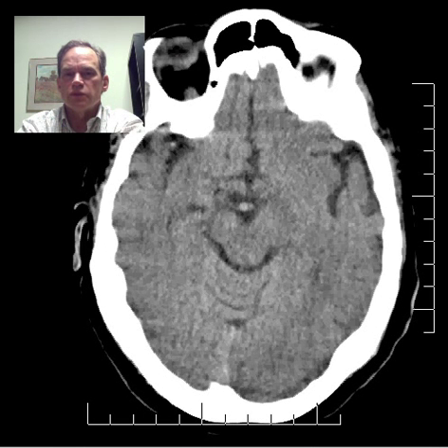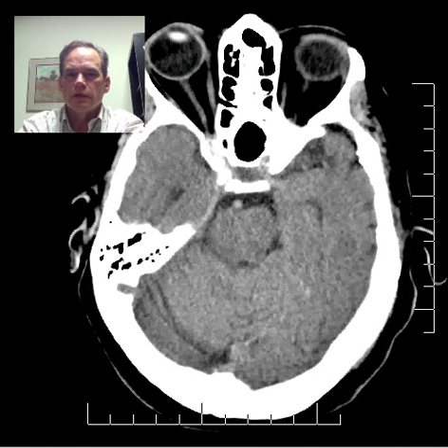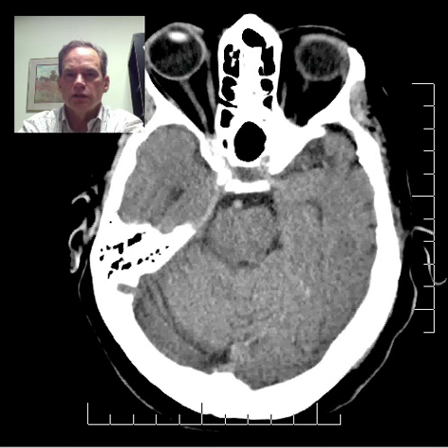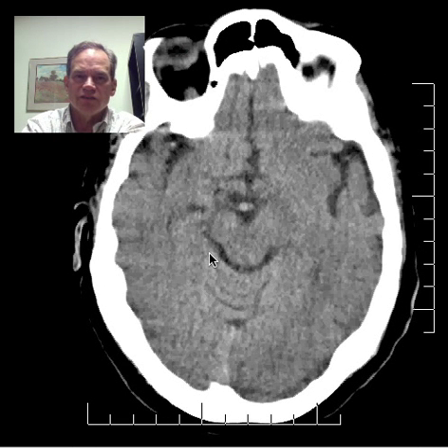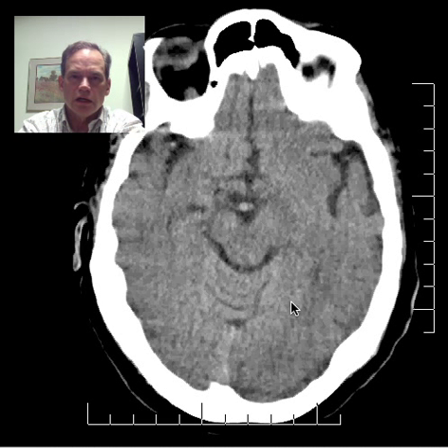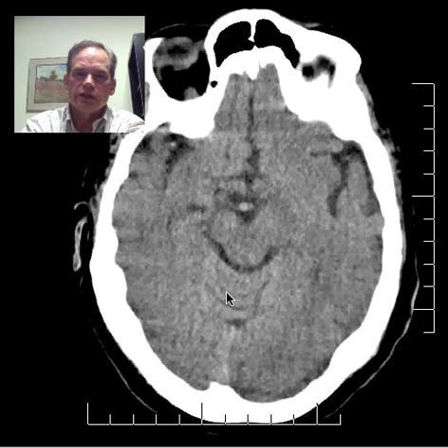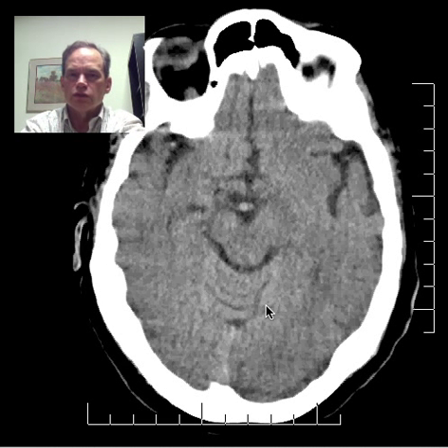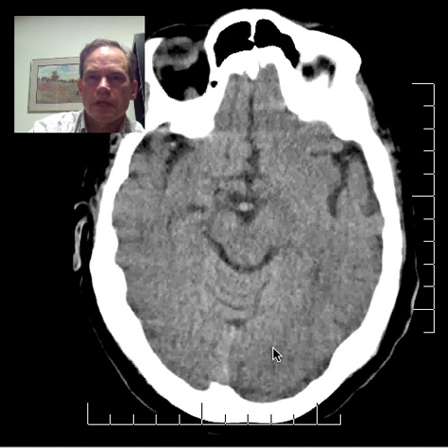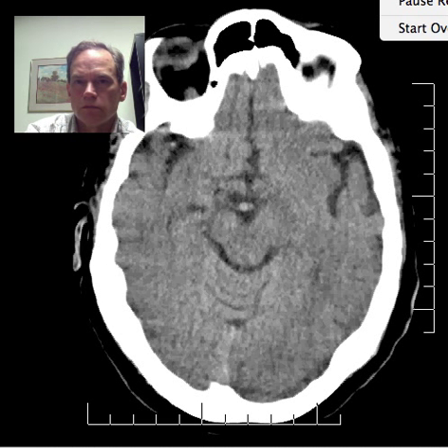The tentorium separates the intracranial cerebral hemispheres from the posterior fossa, which contains the brain stem and cerebellum. As you go up, the tentorium moves in more centrally. What you're seeing is not the tent itself but the transition between cerebral soft tissue above the tentorium and the cerebellum below it. Because the tentorium is sloped on both sides, you see both structures at the same level. That's it for this case — more soon.